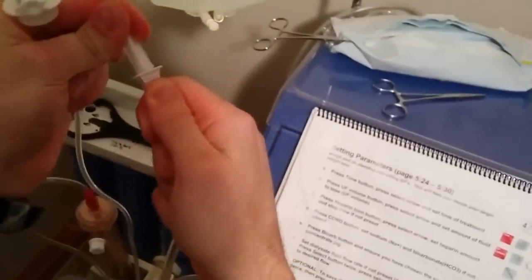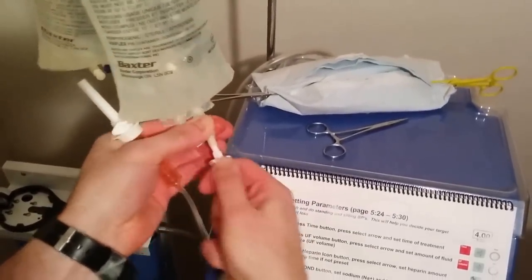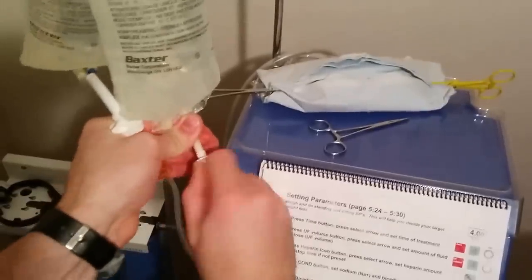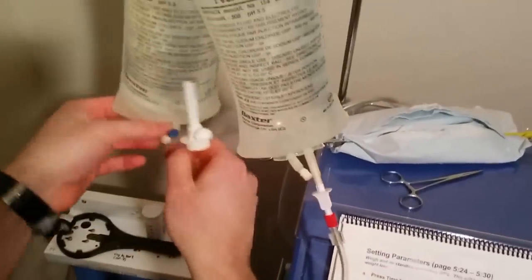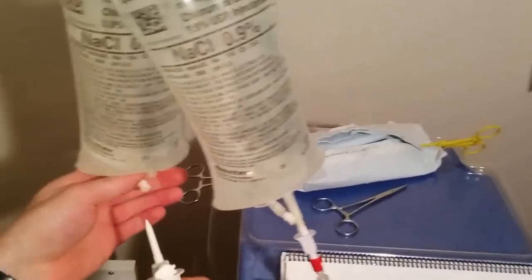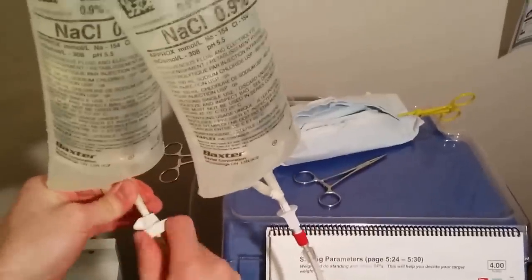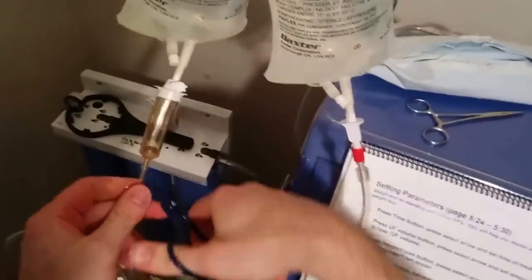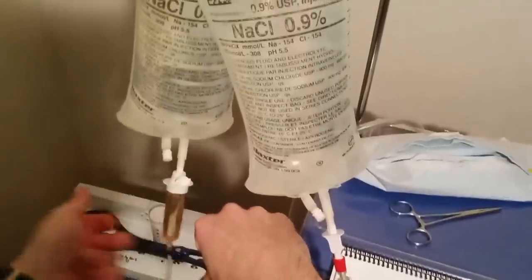There's a spike at the end that we use to pierce the saline bag. Again, we don't want to touch any of it directly with our hands — we want to work around it. So that's connected. We do the same now with the saline chamber, then I usually clamp it off. Just to get the flow of saline going, I'm tapping out any air bubbles — we don't really want air in there.